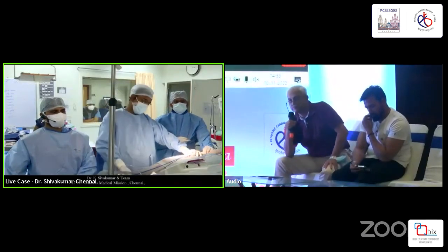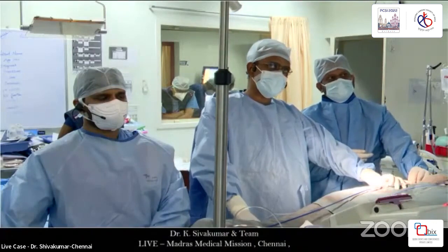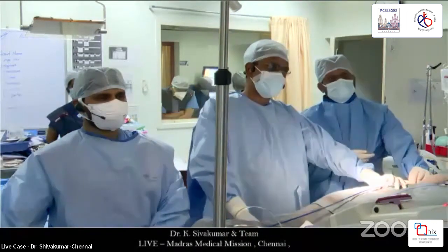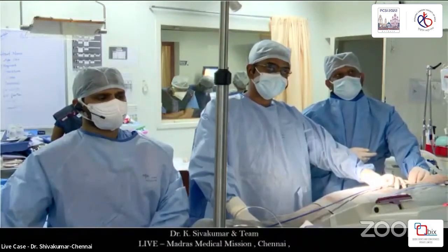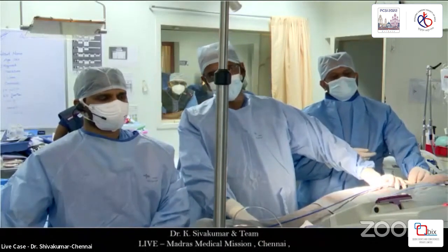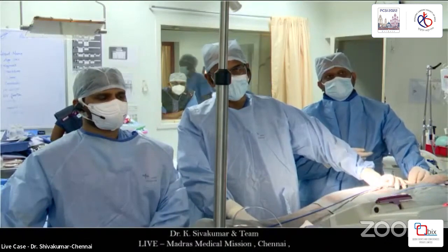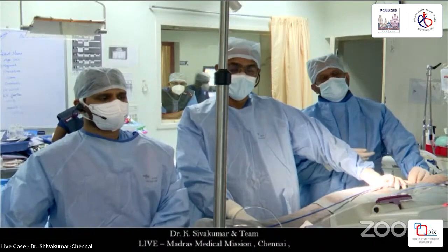Yeah, Bharat, if in all sorts of orthogonal views, if the angiographic as well as balloon sizing are more than 34, definitely we will feel very apprehensive. Even if it is 33 plus in all the views, we will be very skeptical. But if it is 34 or 35 in one view, but in another orthogonal view you are getting like 29 to 30, we will accept it.